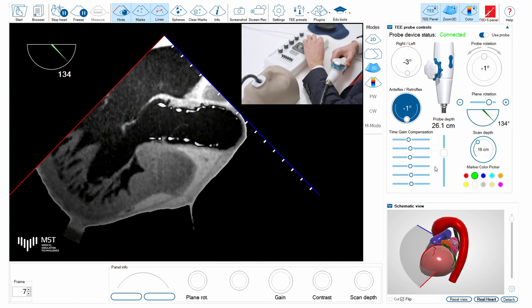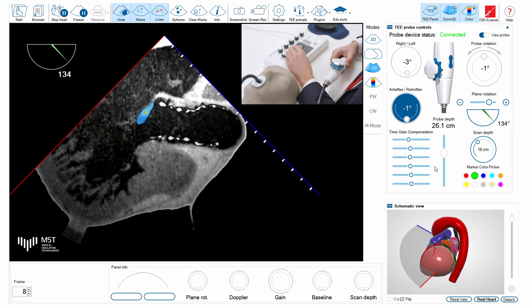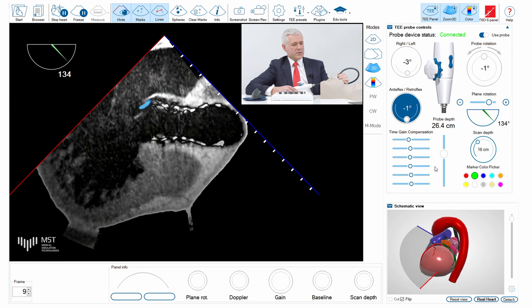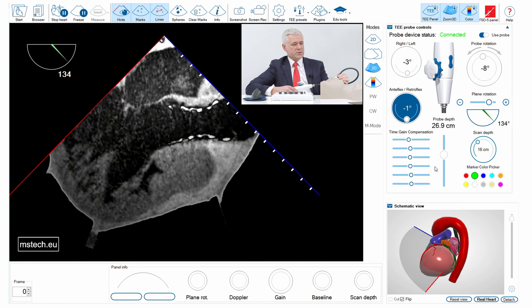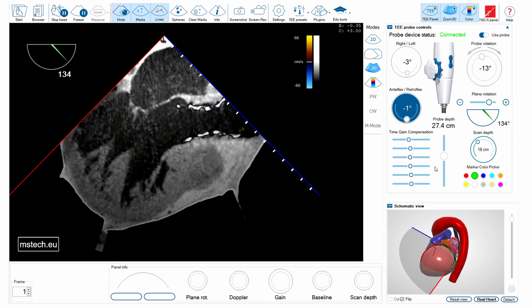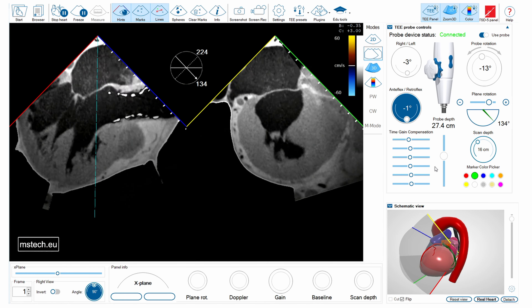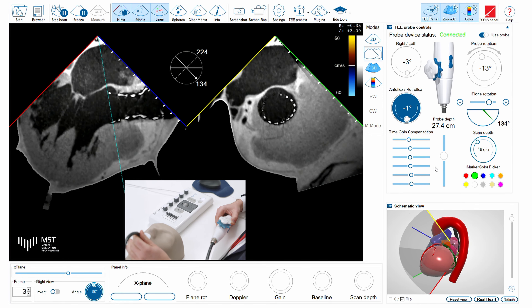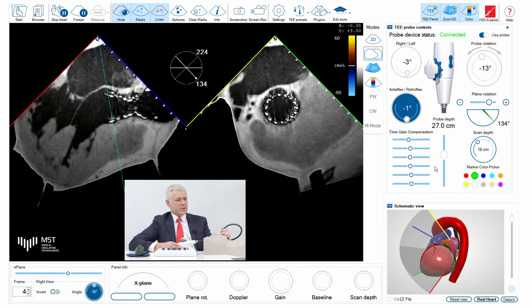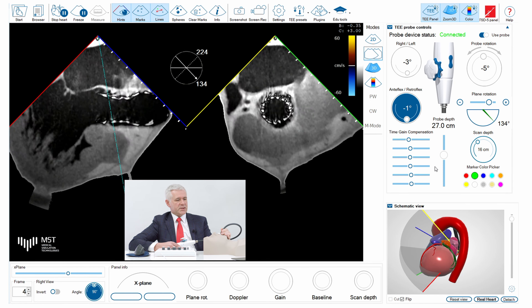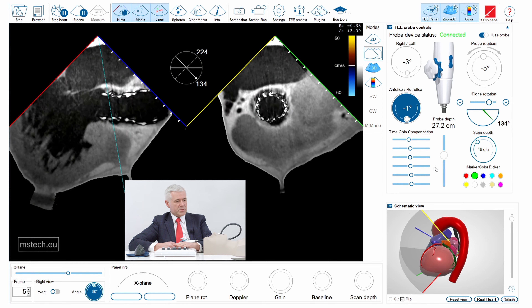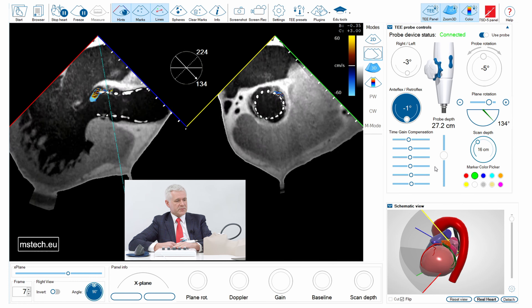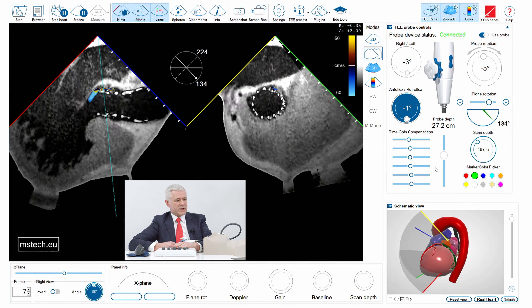Now let's have a look if there is any leakage. You can see that there is some leak. I can manipulate the probe a little bit to see where the leak is located — it's close to the anterior leaflet. We can switch to X-Plane again and see the size of the leak in the short axis view. This is really a minor leak near the calcium that was located there, and probably this is why the valve is slightly leaking outside the stent, but there's no leak inside the stent.